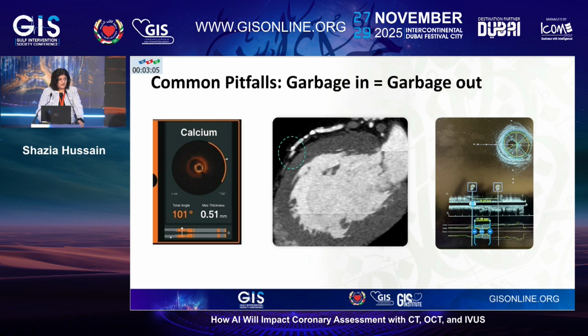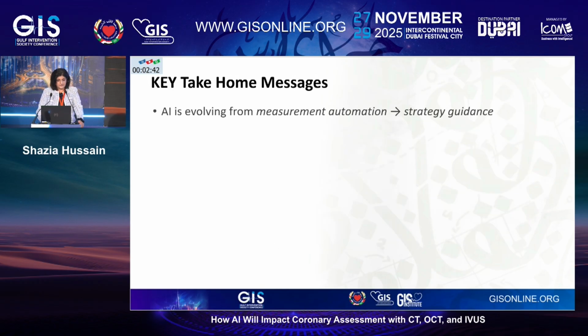Actually, that is completely wrong, because unless you know the technology, you wouldn't know that those markers are actually to a 50% plaque burden, not normal to normal. So you need to be aware of that. And unless you actually go back and look at the images and decide on stent size. So there are obviously pitfalls that you need to be aware of.